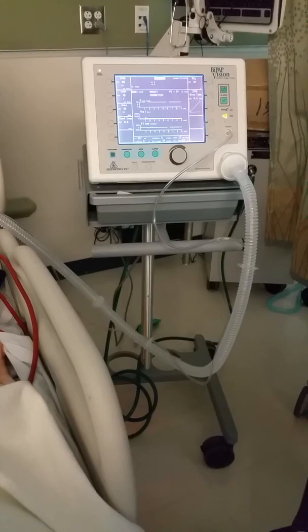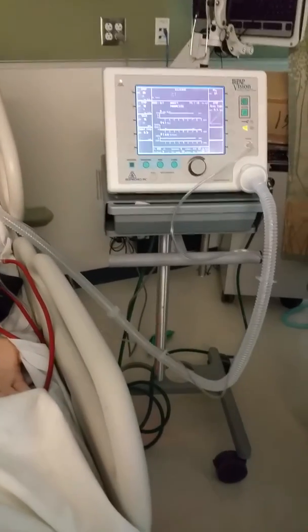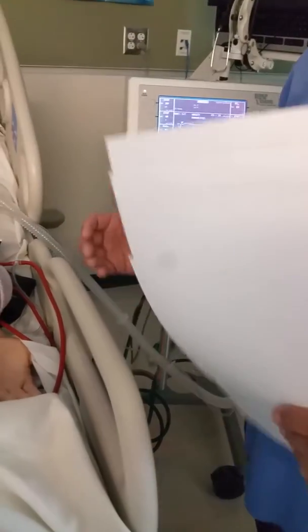I have a question about the leak. Okay. You said 25 or less for this machine ideally. In particular.